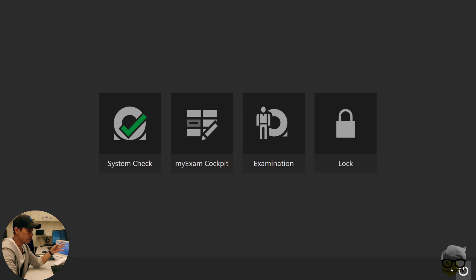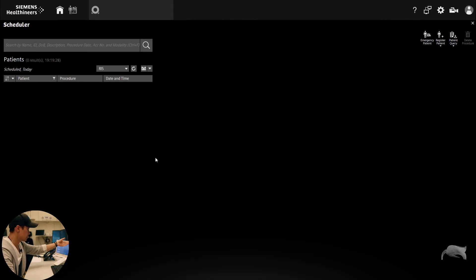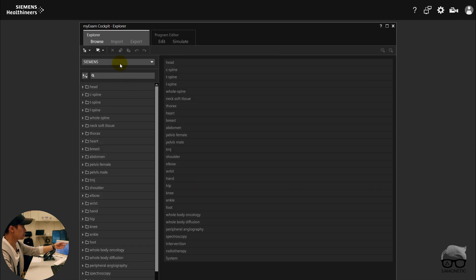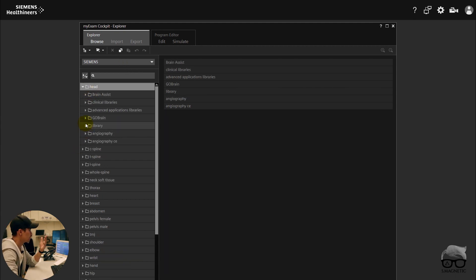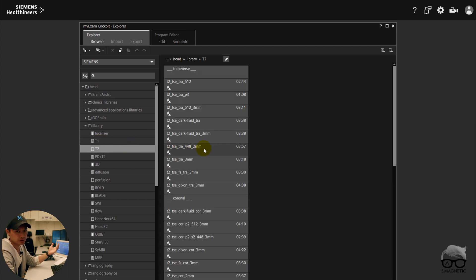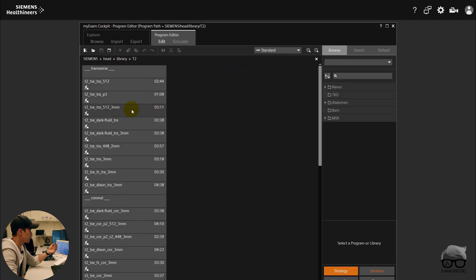The difference with this scanner is that whenever you want to turn it off you just shut down the system and go home — you don't need to wait and push an off button. We don't have any patients today. In the Exam Cockpit right here, you have the Siemens default ones and you also have the possibility to create your own. Let's go into Head and check different sequences. Many of you guys have already asked me about Deep Resolve Boost and how you can find it — let's just find it right here.